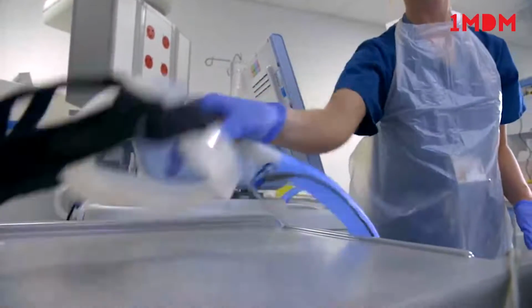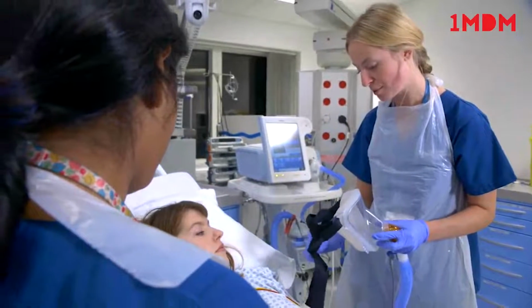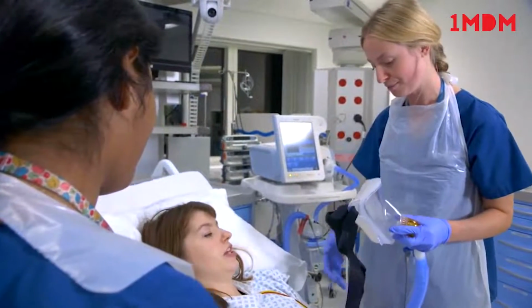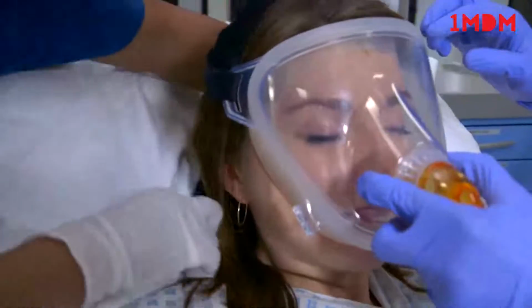Explain to the patient that you are going to fit the mask. The mask will have to be quite tight and held on by straps. This mask will be connected to the ventilator, which will help with their breathing. Explain to them that the mask may be uncomfortable at first. Once the mask is fitted, check the mask for any excessive leak and ensure the patient knows how to both take the mask off and call for help if needed.